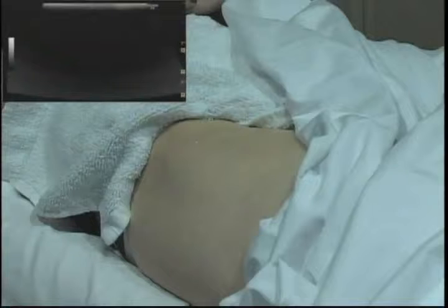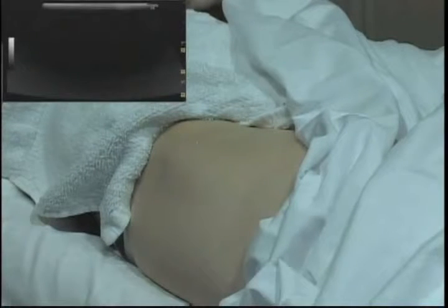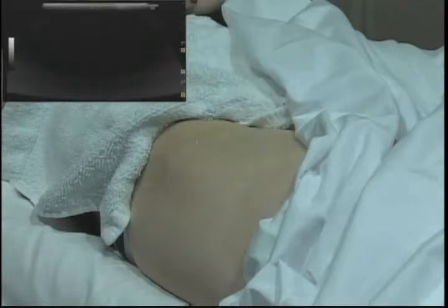So usually when a patient comes to me with hip pain, the bare minimum will be the hip joint and the trochanteric area. By far that's the most common site for pathology. If someone has a sports type injury with groin pain, then I'll move on to the other anterior hip structures, which I'll talk about. I usually only look at the hamstring, of course, when they have hamstring symptoms. So that's my approach to the hip.